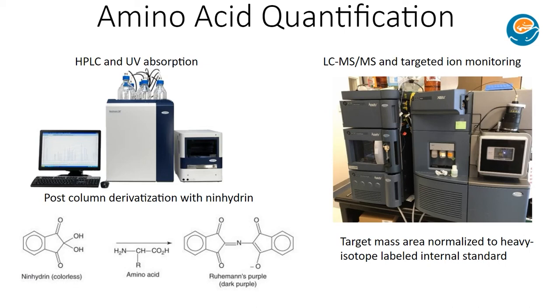Many other laboratories, particularly big reference laboratories that offer biochemical genetic testing, are moving in the direction of tandem mass spectrometry as a method of measuring free amino acids. Tandem mass specs are incredibly powerful and technically challenging. One of the things I like to tell folks that come through the lab is, with great power comes great vulnerability. The mass specs are incredibly powerful devices for measuring specific compounds, but they're not so great at the unexpected. And they are also very technically challenging to maintain, and the initial assay development is also quite challenging.